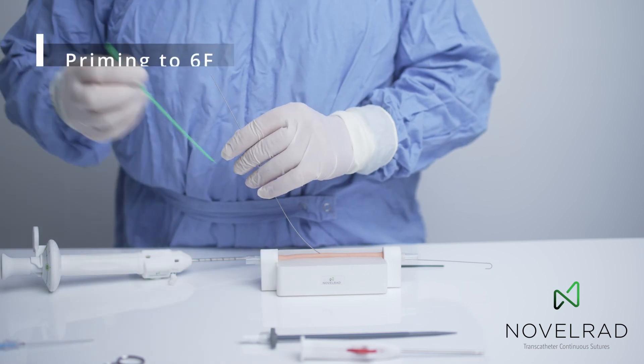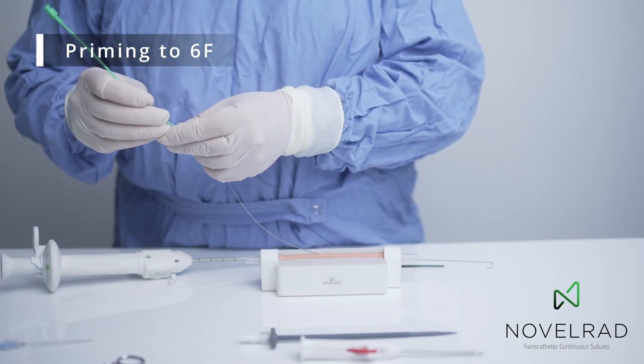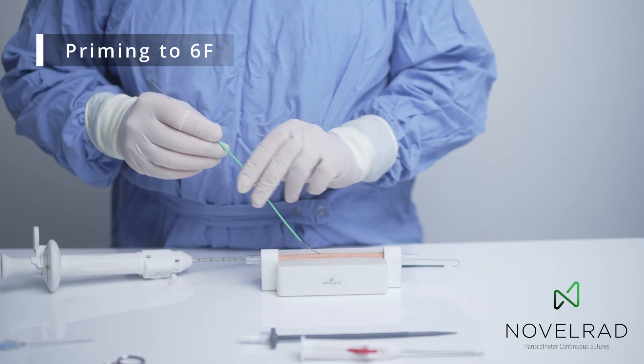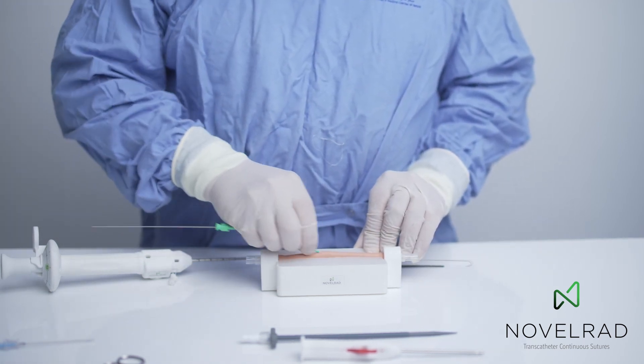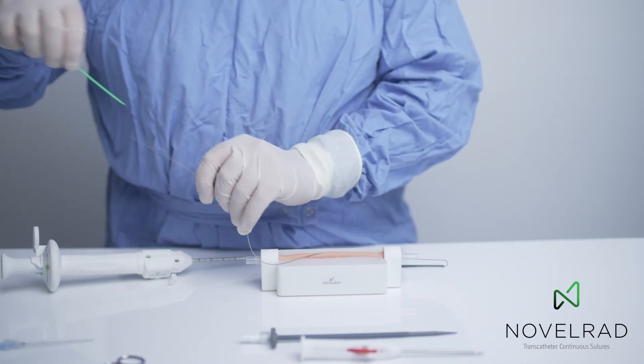We just prime the hole — the arteriotomy — with a 6 French dilator so that we get a nice round hole through which we can advance the Novelrad device. And this would be done with a regular artery as well.